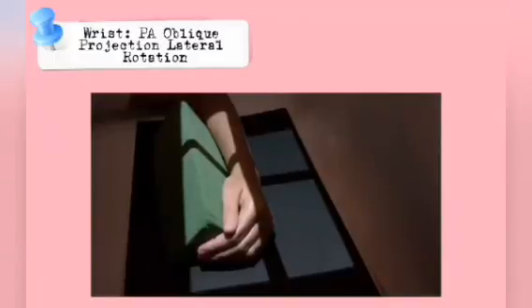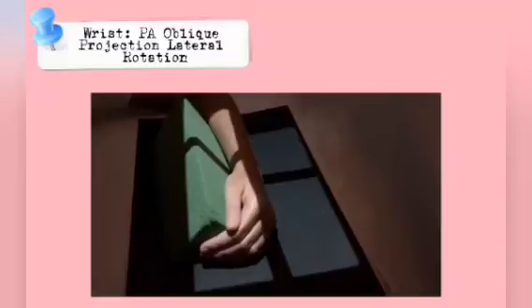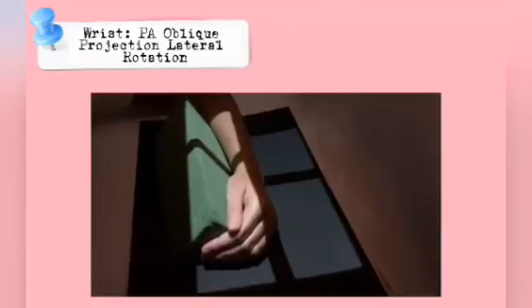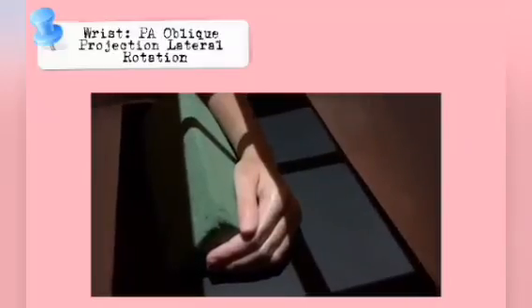PA oblique projection, lateral rotation, position of patient. Sit the patient at the end of the radiographic table, placing the axilla in contact with the table. Position of part. Rest the palmar surface of the wrist on the IR. Adjust the IR so that its center point is under the scaphoid. From the pronated position, rotate the wrist laterally until it forms an angle of approximately 45 degrees with the plane of the IR.